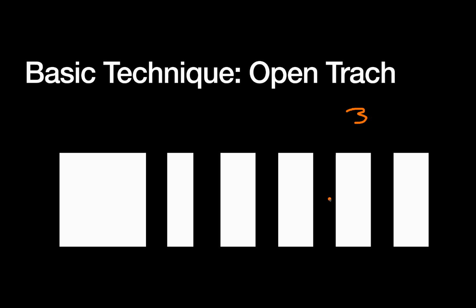I had a lot of trouble understanding that at first. But typically what you do is you make 2 incisions horizontally in the space between the second and third ring, and then the third and fourth ring. And then those are typically done with the scalpel. Then you typically take a scissors and connect the two. And you can see how that makes an H here, and that creates a nice big opening here for you to insert the tracheostomy tube into.